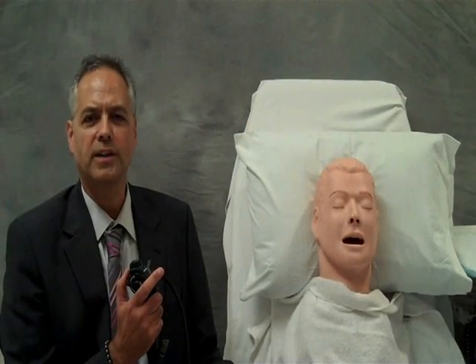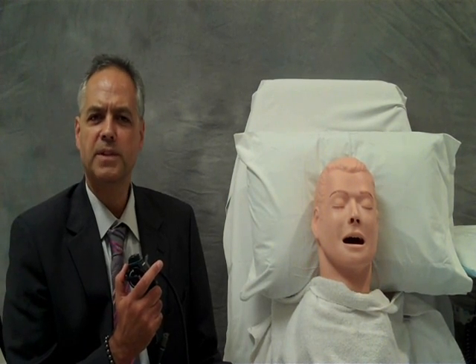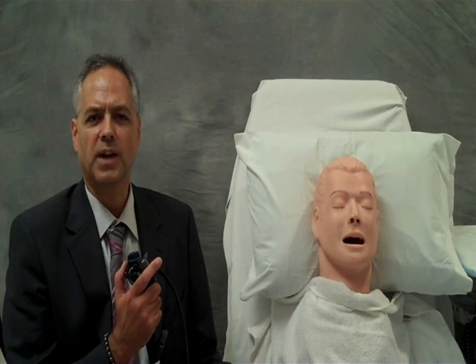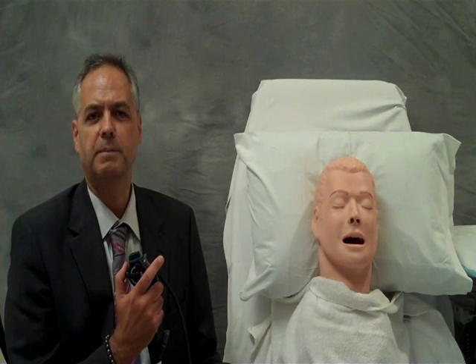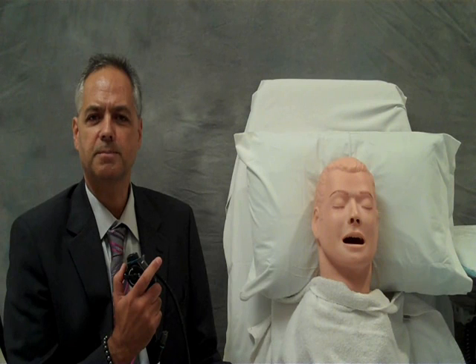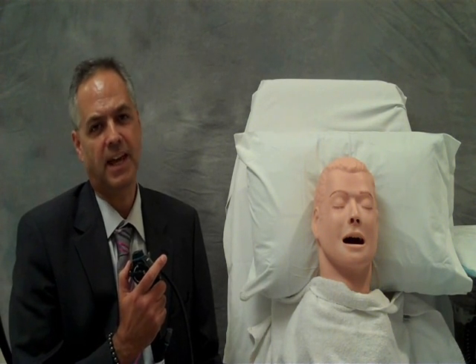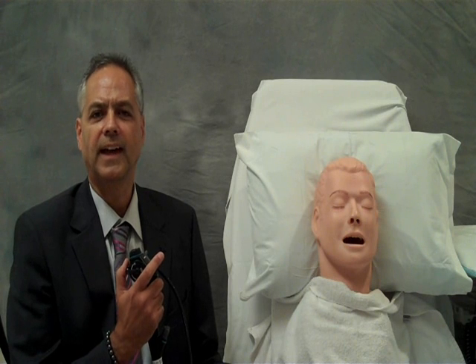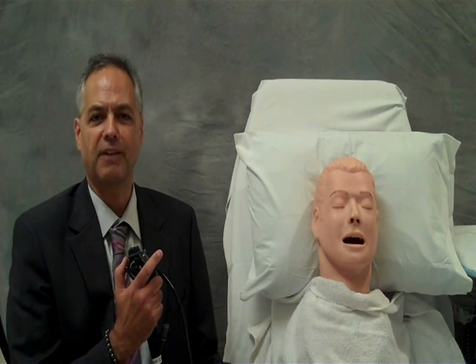We hope that you enjoyed these bronchoscopy step-by-step exercises. The movements are essentially the same, whether bronchoscopy is performed from the front, the side, or the head of the patient. Remember these basic principles of bronchoscopy: decision, intent, control, and confidence. These principles lead to a safe and effective procedure.